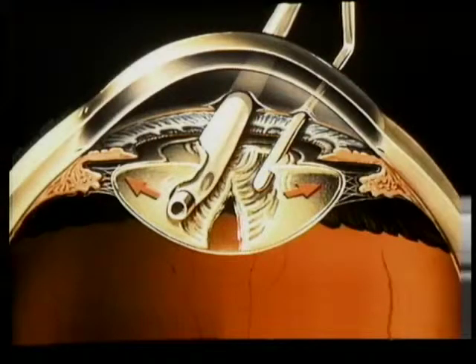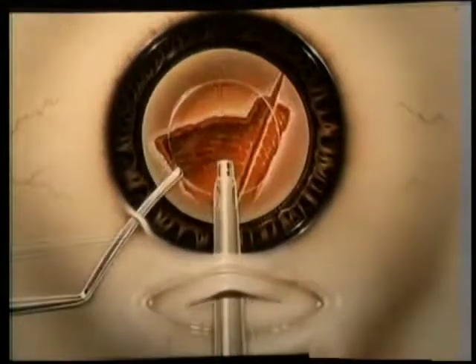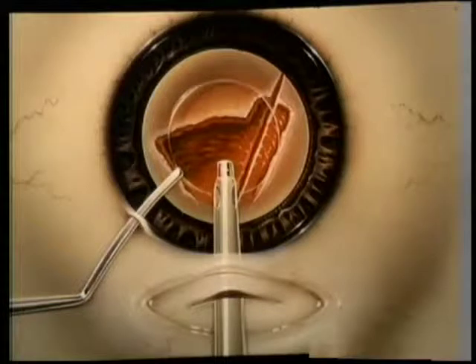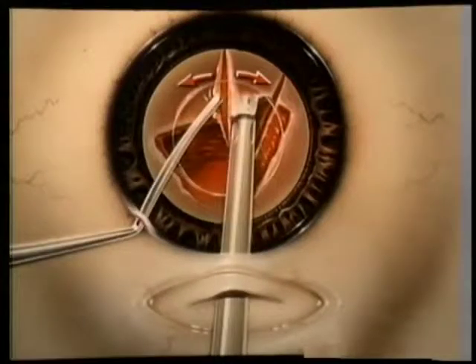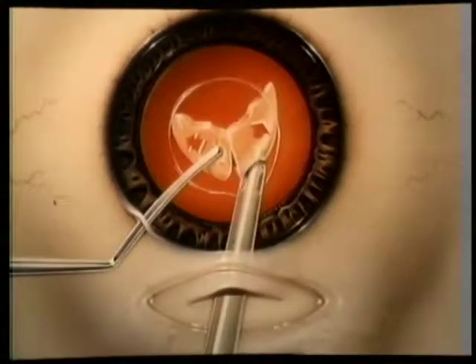When the instruments reach the posterior portion of the lens centrally, they can be utilized to fracture through the posterior plate of the nucleus and the epinucleus if it's firm as well. Alternatively, additional sculpting can be done in the upper portion of the lens just to debulk the lens. And then additional fractures made through the thicker rim inferiorly. And these sections can either be emulsified as they're broken away or left in place as the lens is rotated for additional fracturing. Larger segments like a hemisection left can be fractured with the two instruments.